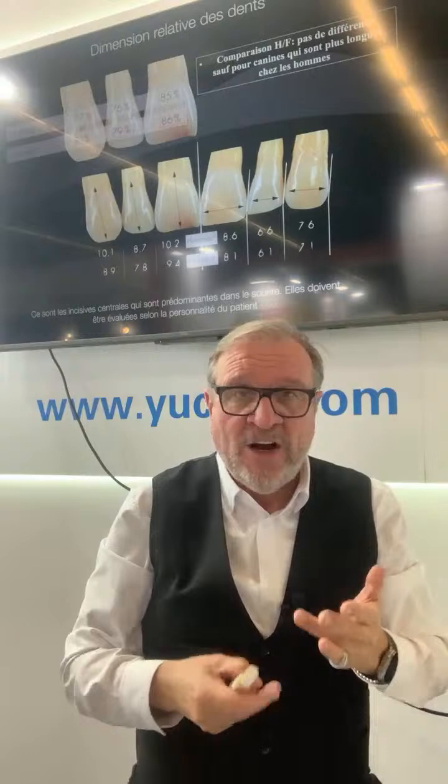So this is one thing very interesting. Also the contact point is not like that. It has to be a convex curve between all the things. So each thing, the proportion of the teeth are also very important. For a woman, it's about 81%. For a man, it's about 77%. So it's different, and you make a crown who look like masculine or female crown.